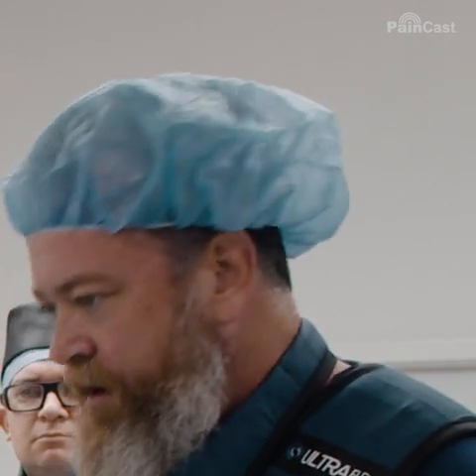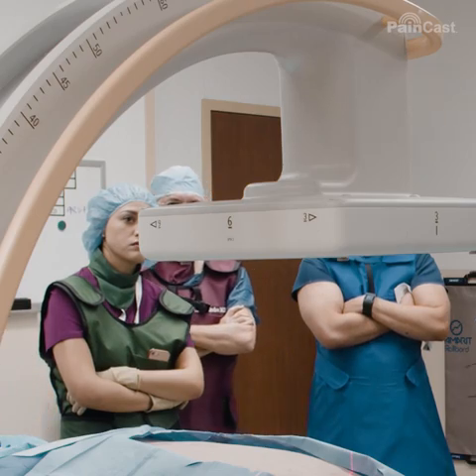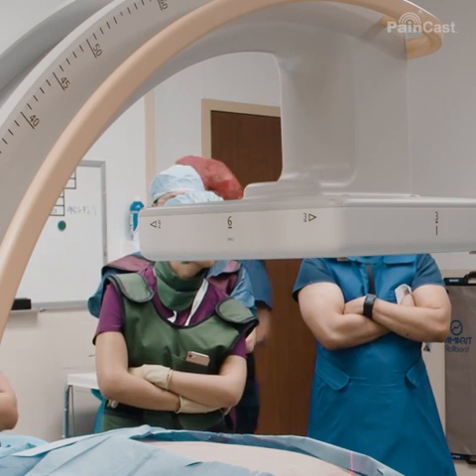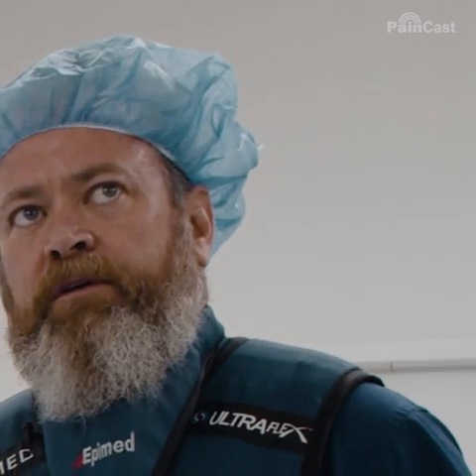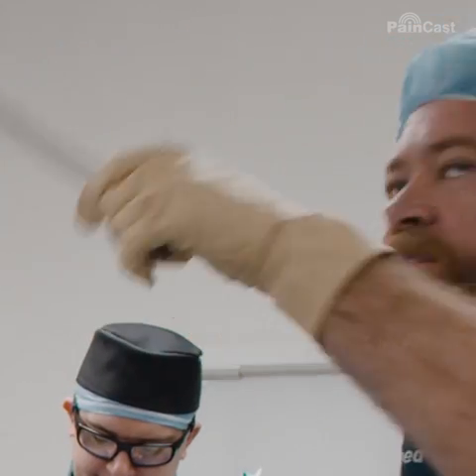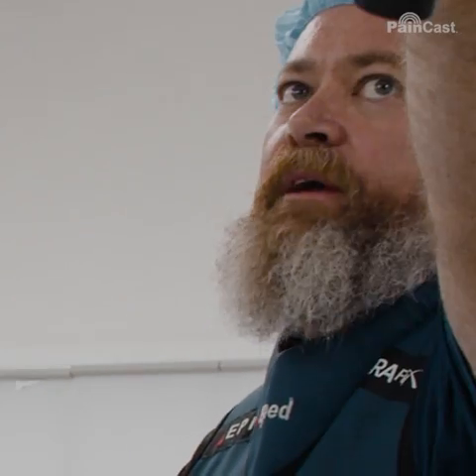Go ahead and tilt towards the feet just a little bit. You're trying to kind of flatten things out a little bit — there are two ways to look at it. So by going that way, I've kind of closed down my space a little bit.